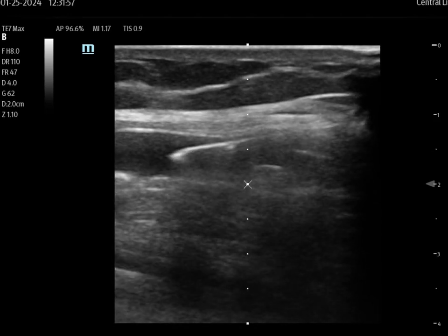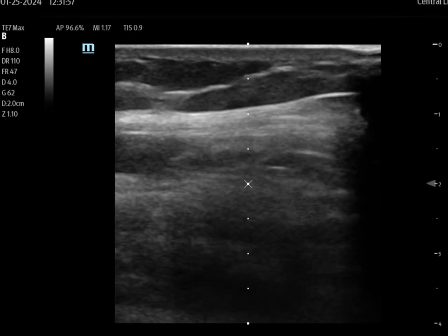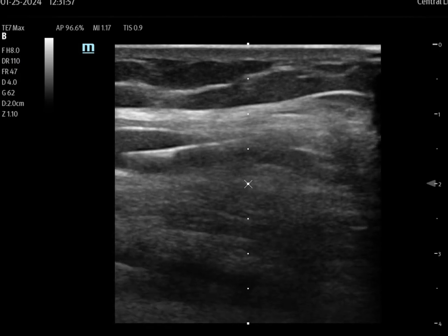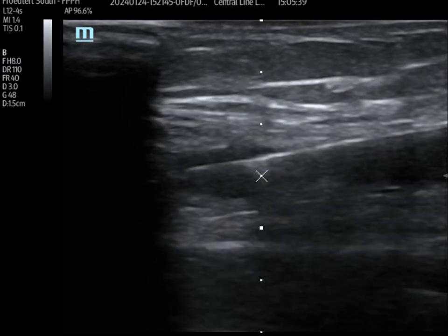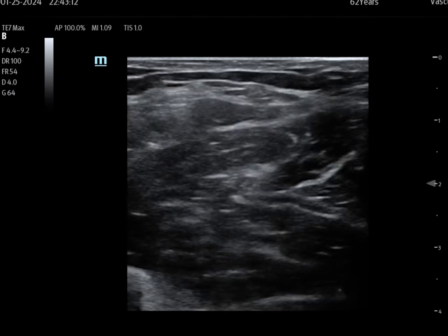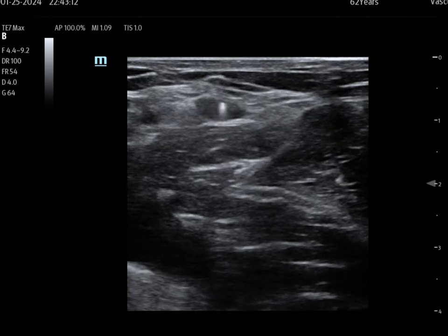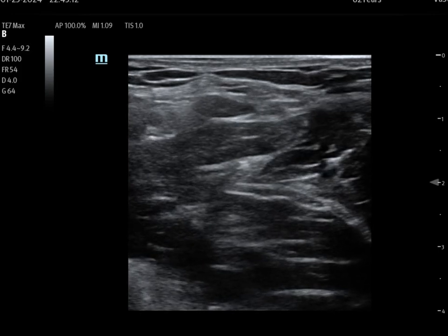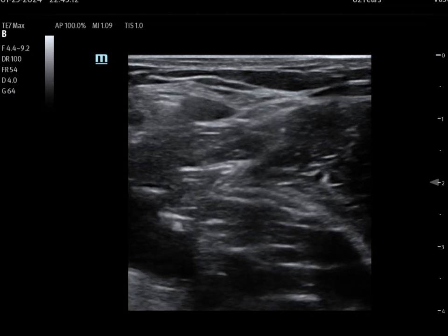In this sequence of clips, I'm using the BD PowerGlide midline and deploying the guide wire. What I like to do is use that to confirm the needle is actually in the vessel — when I advance it, there's no question about where the catheter is going to go; it's going to go in the lumen. Here is a short axis view as well. I was having trouble obtaining long axis due to anatomical considerations. Pushing the guide wire forward and backwards allows me to confirm I am indeed inside the vessel, and I'll advance the catheter off of the midline device.